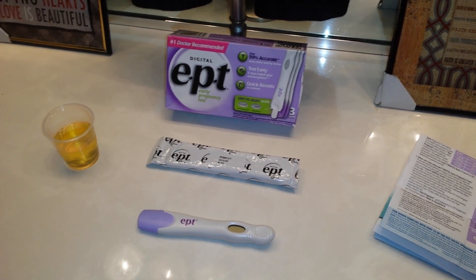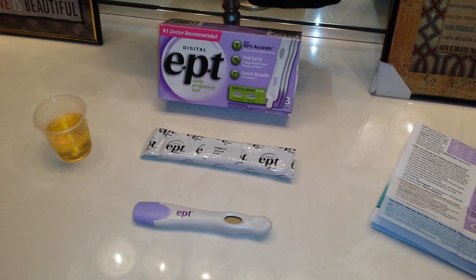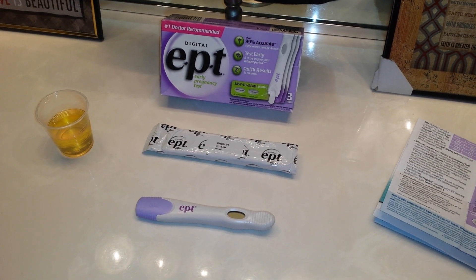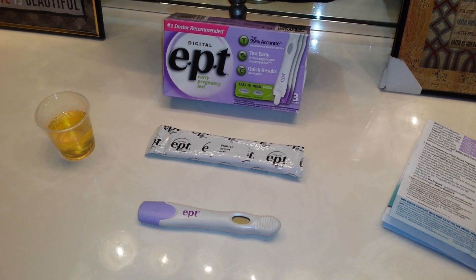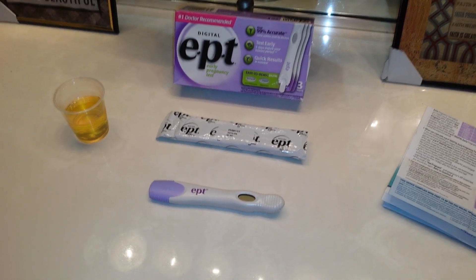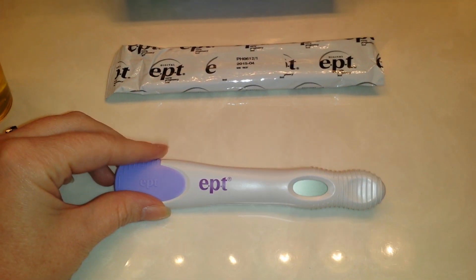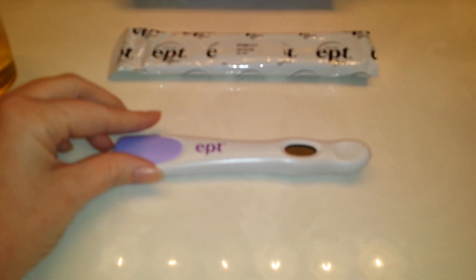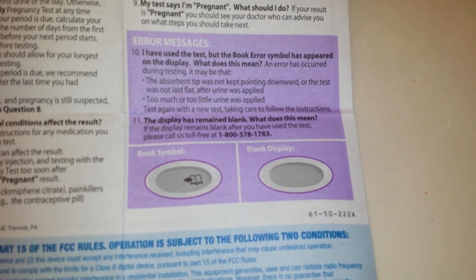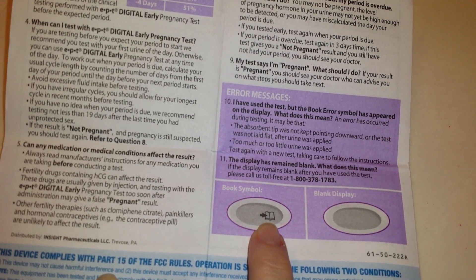I tried contacting the manufacturer before making this video but unfortunately their office was closed — it was 4 p.m. central time and they close at 5 p.m. eastern time, so they're an hour ahead of us. When you take it out of the package it comes with a purple lid, and this right here is the result window. I want to show you what an error message will look like — if you get something that looks like a little notebook, that's an error symbol.